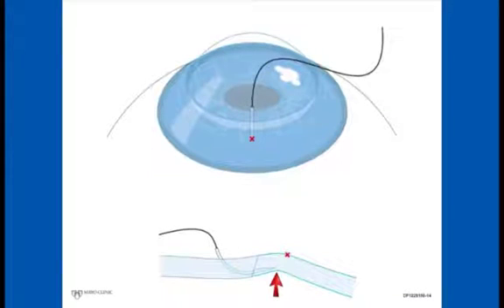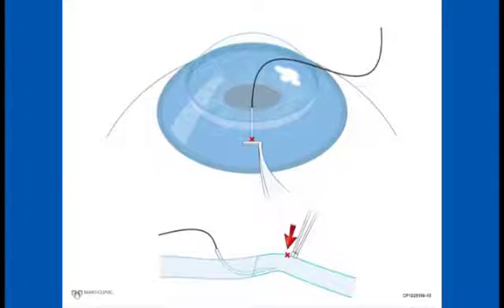How do we accomplish this goal? First, we use the needle holder to rotate the tip of the needle 90 degrees on its axis from its initial position parallel to the host posterior surface. Once that rotation occurs, we don't drive the needle to the surface with the needle holder. Rather, we drive the cornea into the needle with the colibri.